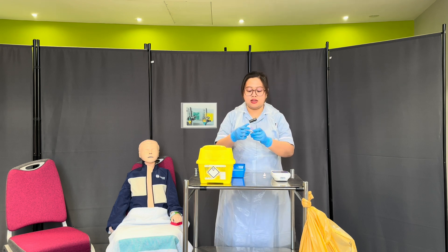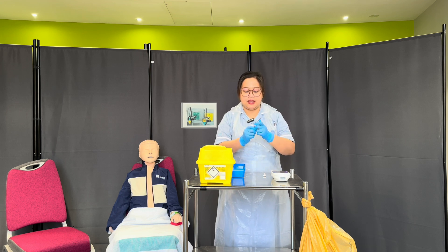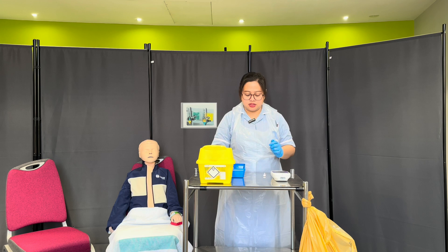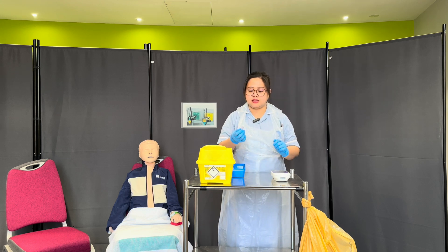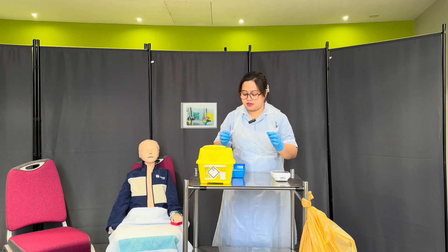I have here my test strips. The container is airtight, clean, and the expiration date is 2024. There are enough strips, so I'll be happy to use this. I have here my single-use lancet, and the safety is still in, so I'll be happy to use this.